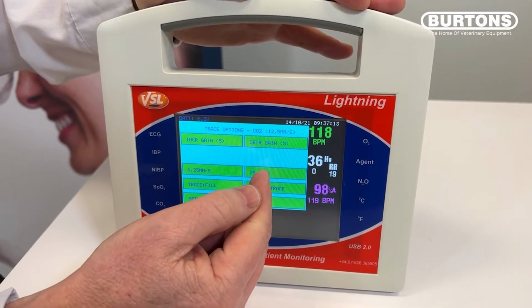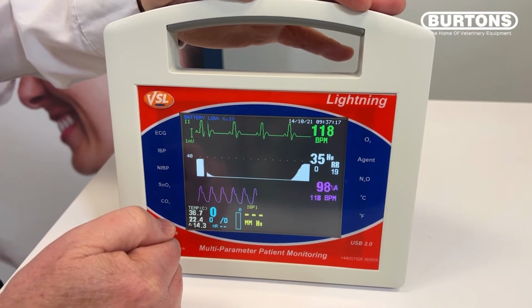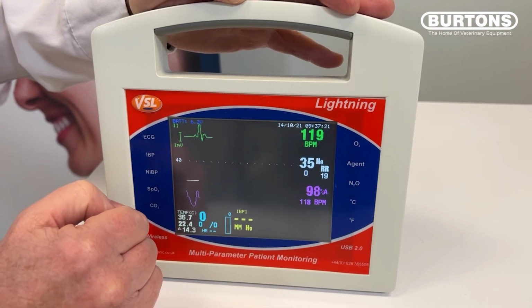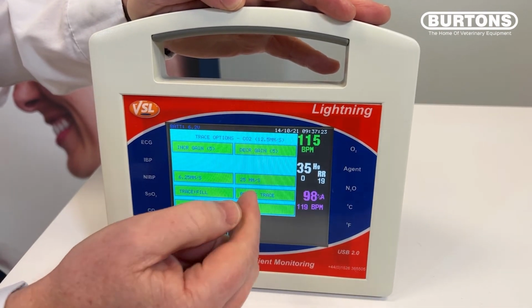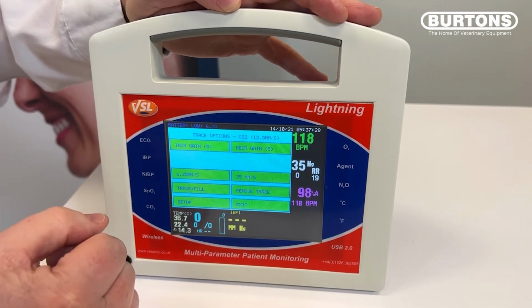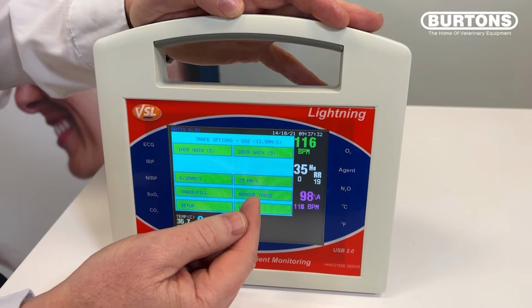So if I were to touch 25 millimeters per second, we've now increased the speed at which that passes across the screen. If I want to change that again, simply touch the unit and go back to our previous speed. So in this manner, whichever trace you touch, it will always bring up the options for that trace. One feature that's also there, as you can see, is the option to remove the trace.